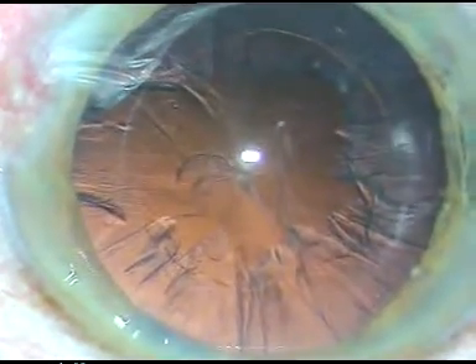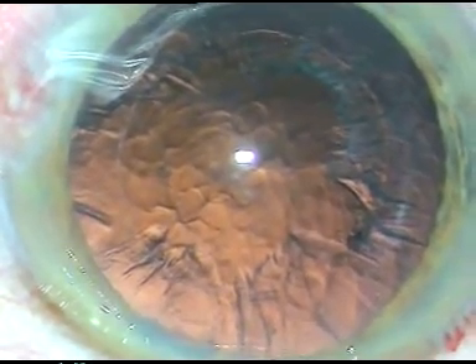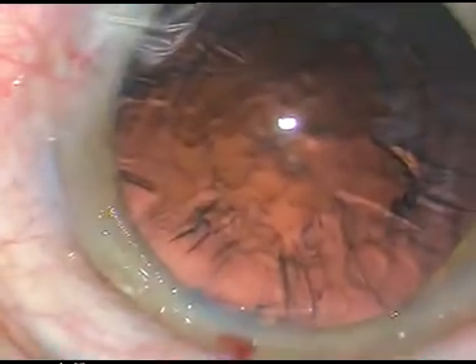Now, in this case I want to use bi-manual irrigation/aspiration but I don't want to waste any time. So while my assistant is preparing the bi-manual irrigation/aspiration, I am taking the IOL, examining the lens to check whether it is good or not. Sometimes there may be some particles sticking to the lens. The lens is fine. I am placing the lens inside a cartridge. It is a hydrophilic lens from another company. The lens is now ready for implantation.